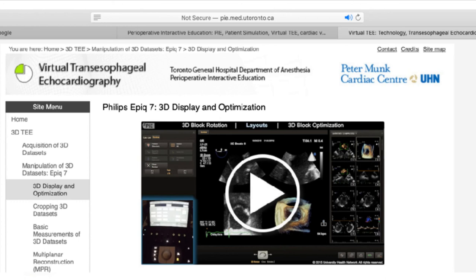One feature that all vendors have tried different ways to address is making blocks look as three-dimensional as possible. One unique feature of GE is something no one else has - it's called stereo vision. Stereo vision gives us a block that with the naked eye looks a bit weird, but with 3D glasses with red and blue, you would see the structure popping out of the screen. That works for 2D images, for the 3D block, the tissue itself, as well as with color.